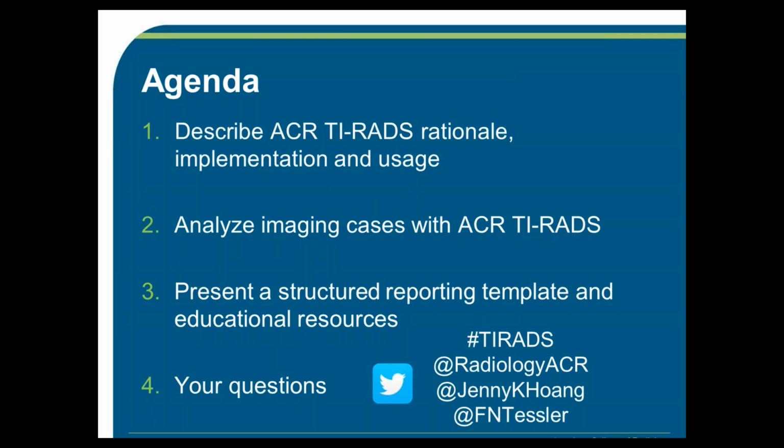Then Bill is going to spend some time going through cases with you. He's going to go through the lexicon of ACR TI-RADS so that you can interpret your nodules with confidence. And then I'll finish off with a short presentation of the structured reporting template that you could use and also give you a website where you can get some additional resources.